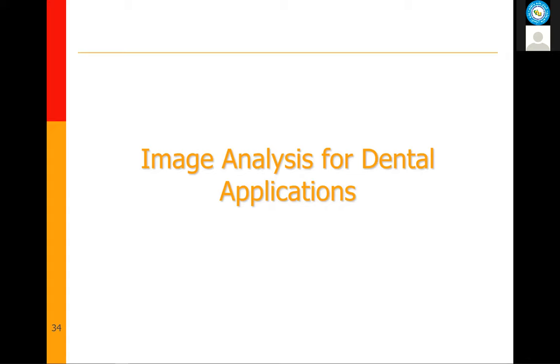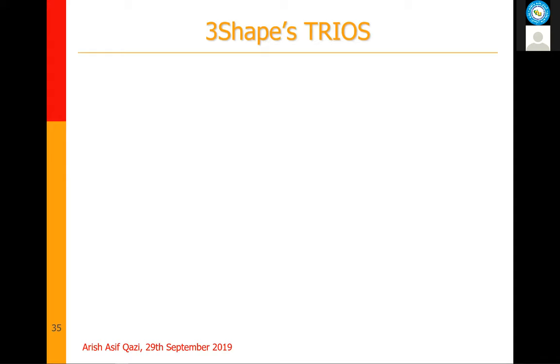So an example is 3Shape's TRIOS. 3Shape is a company based in Denmark, and we started development of an intraoral scanner. The idea was to enable a digital dentistry workflow. When a patient walks in, a dentist takes an impression of the teeth to see if the teeth are aligned, or, let's suppose, if the teeth are missing. Now that impression, they have to go and then scan, and it's all time consuming and leads to more chair time for the patient. Now the idea was to develop a scanner where you could directly scan the patient's teeth without taking any impressions.